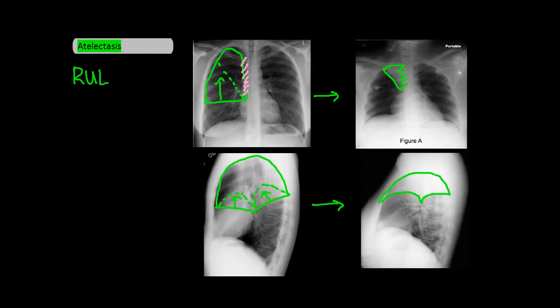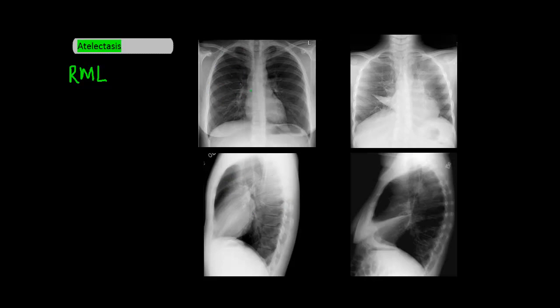Next is the right middle lobe. On the PA, the normal right middle lobe dimension is here. But with right middle lobe atelectasis, this border contracts, and you should also have silhouetting of the right heart border. An example of this is here. On the lateral, the normal right middle lobe is here, but with atelectasis, the minor and major fissure that borders the right middle lobe move inwards.